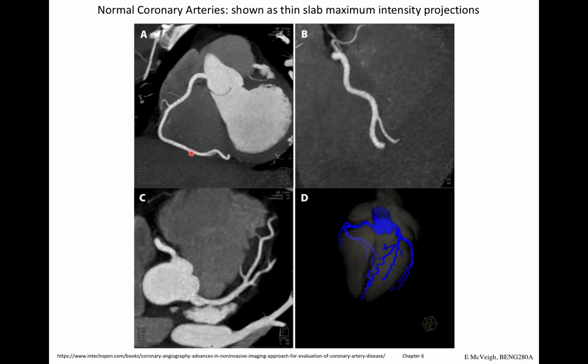And coronary CT has a 99.5% negative predictive value. So that means when you call somebody normal, they are normal. It's very hard to make a normal looking picture if you're not normal. Vice versa, it's different, in that there are a number of ways in which you can make a picture look abnormal when the person is in fact normal, but the reverse is not true.